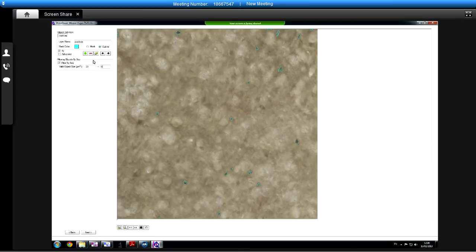Yeah, so coming down a little bit, but then taking away a little bit of the light brown, so we're only really focusing on the dark. So although here we're not marking the whole thing, I don't think we really care because we're marking it as a positive, aren't we? We're just looking at this one here. That's one really, isn't it? And it's being considered one at the moment, so that's okay. I'll just replace the other one there. Do you want to replace it? Yes.